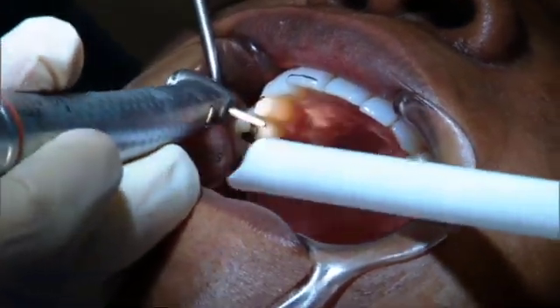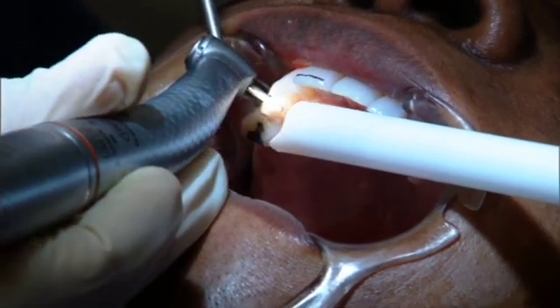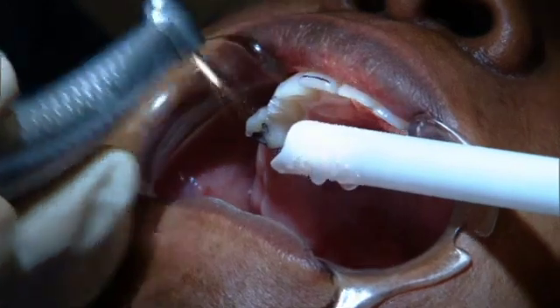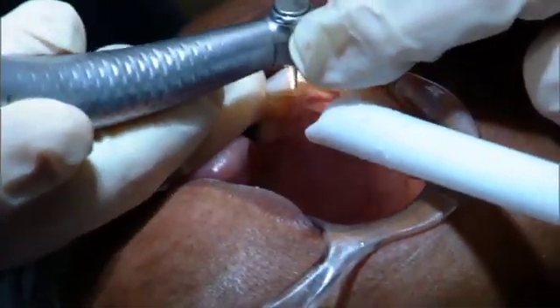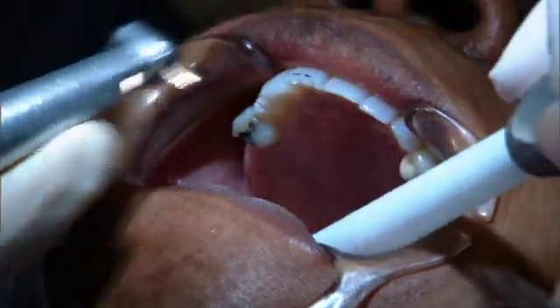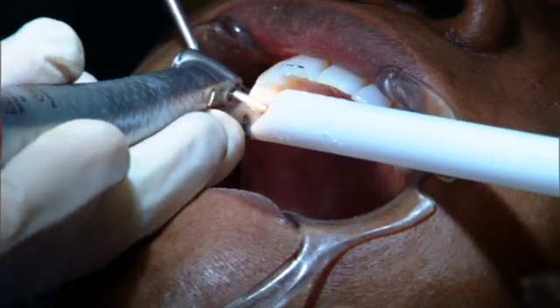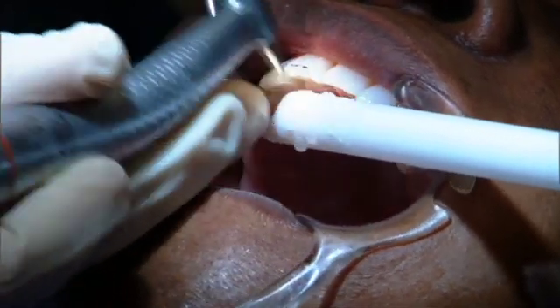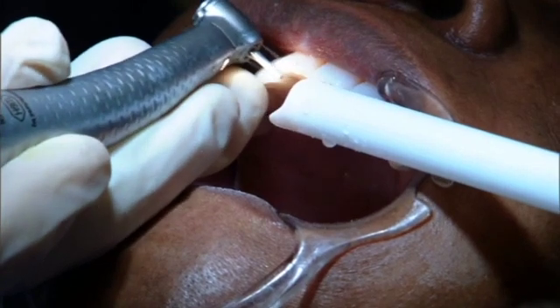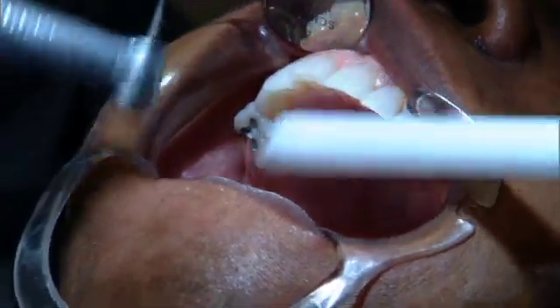In preparing teeth, I learned in dental school, instead of shaving it down, actually make a cut. So we'll make our depth cuts right to the line on the canine and the central. So with those depth cuts, all we have to do then is just connect the dots. In knowing your armamentarium and the diameters of the burrs, you can verify that you have the right amount of space.